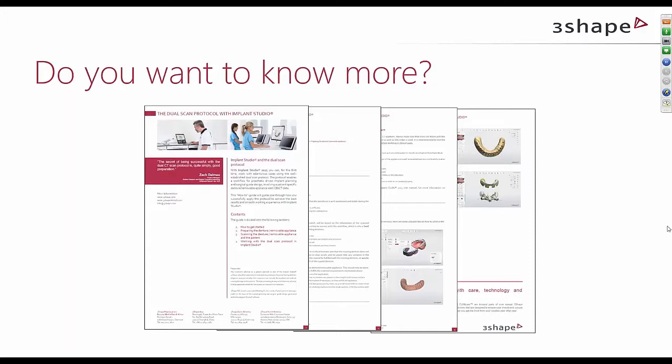There's a question coming in whether we're able to make bone supported guides yet in Implant Studio 2016. The answer is that the workflow we just demonstrated here is for gingiva supported guides. We are looking into the requirement of a bone supported guide workflow as well. It's something that is still to come, and it's not included in Implant Studio 2016.